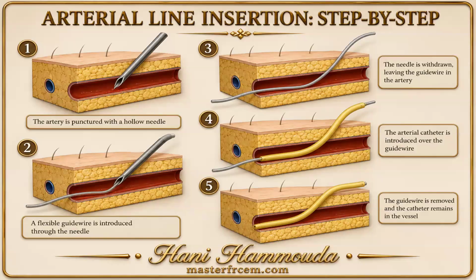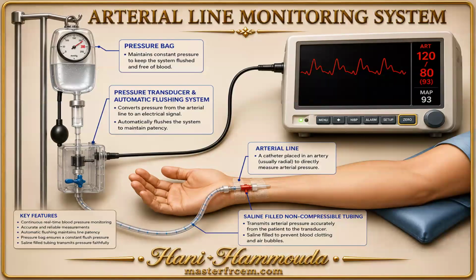Once you insert the arterial cannula, you will attach to what is this? Transducer. Beautiful. So pressure transducer and automatic flushing system. If you did not see it in the emergency department at all, no worries. It's very easy. Even in the exam, you will see it for the first time.